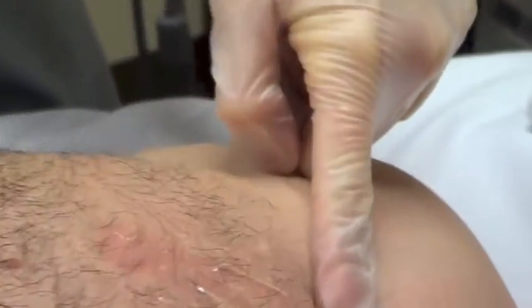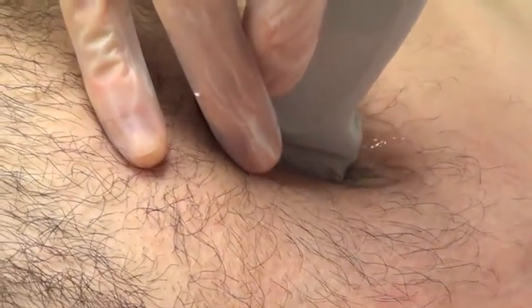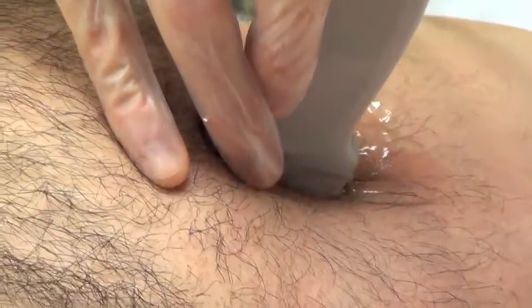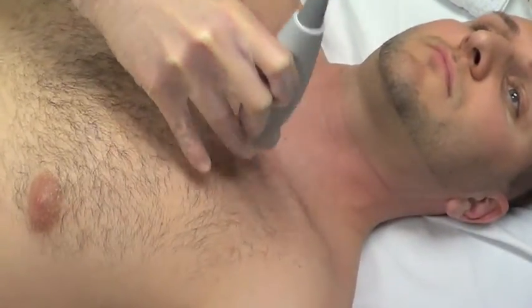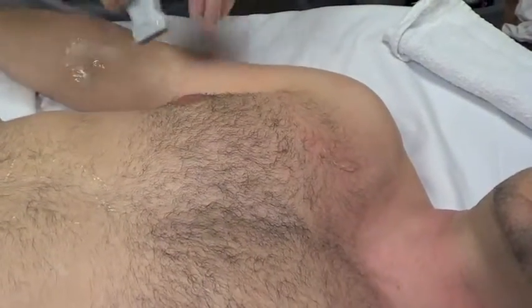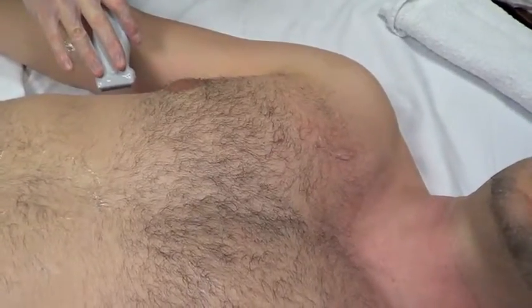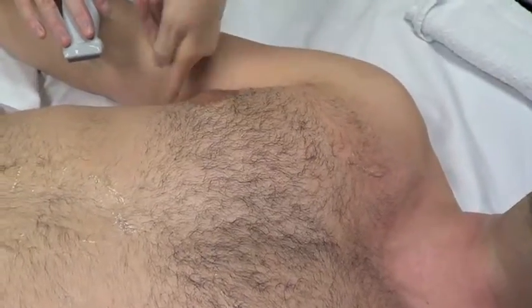We're going to start here in about the second intercostal space. We'll center our pleural line between the ribs. Typically when somebody is supine — which is most trauma patients lying flat — your most sensitive area is going to be here in the apex, because air rises. We'll look here and here. You can go all the way down and into the mid axillary line. If you see a pneumothorax, you may want to trace it down to get an idea of how large it is. The larger the pneumothorax, the more areas you're going to see it in, tracing downward.